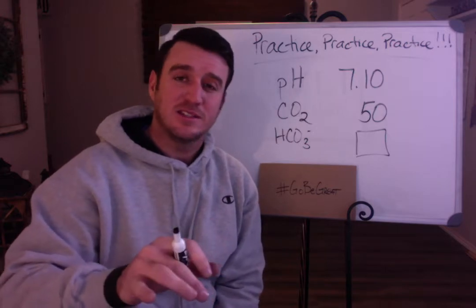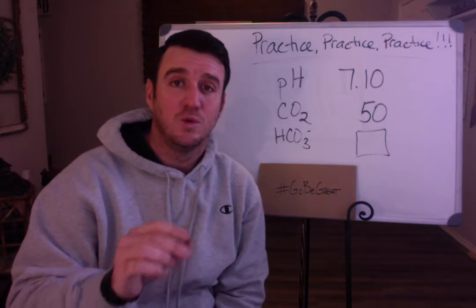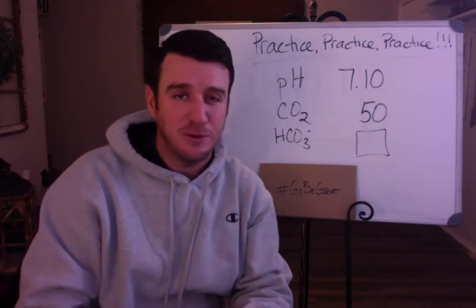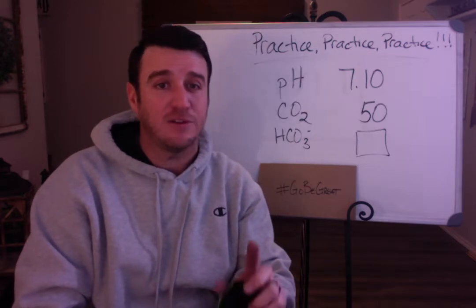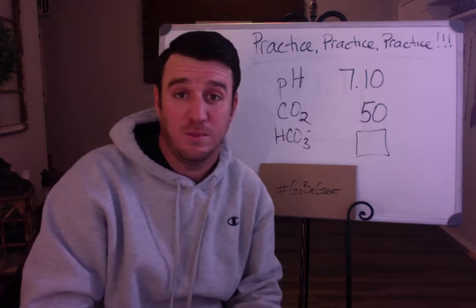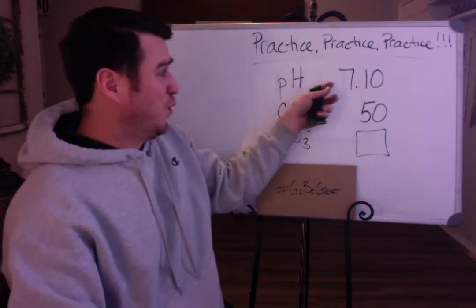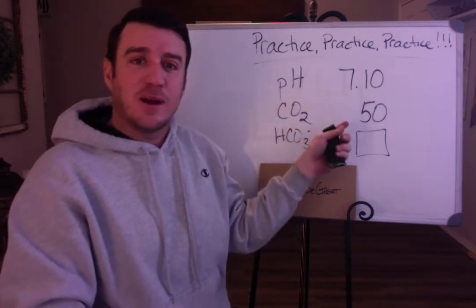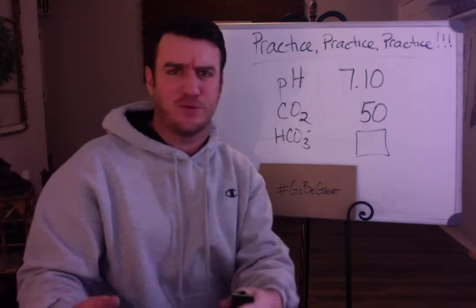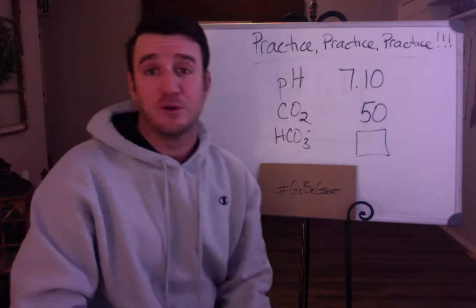When you look at this, you have to understand that a CO2 of 50 would cause you to have an acidotic pH. But a CO2 of 50 would not cause you to have a pH so significant down to 7.10. So you have to think, we're really acidotic, even though our CO2 is not that elevated. 35 to 45 being normal, 50 is elevated, but not to the point to cause 7.10.